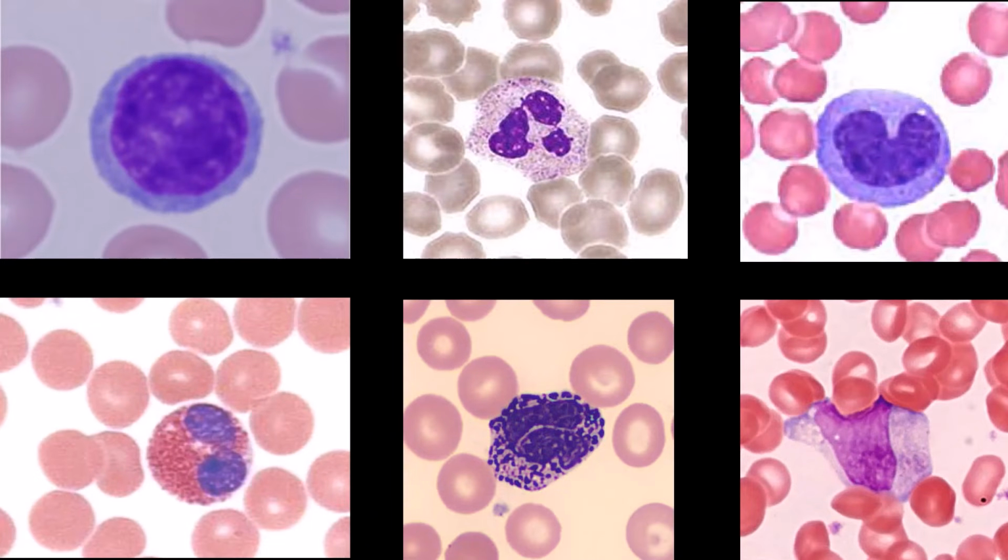I think it's helpful first to see if you can tell what they all are when you're looking at all of them. So starting here, this is a lymphocyte, and you can tell because it has the one large circular nucleus.